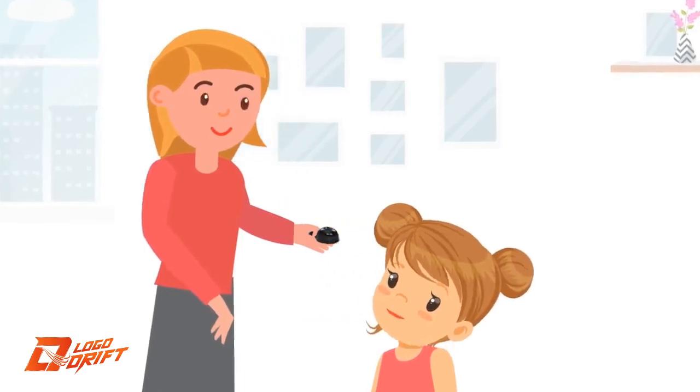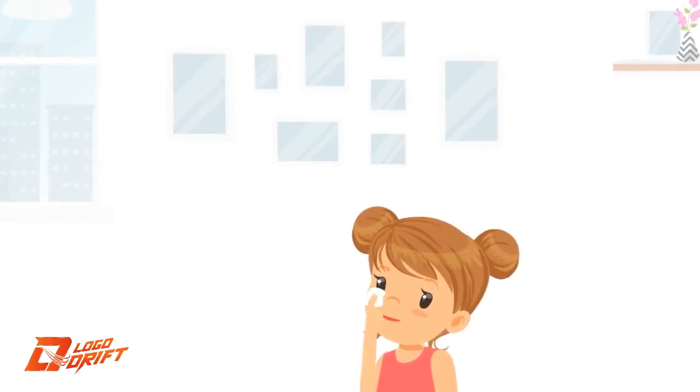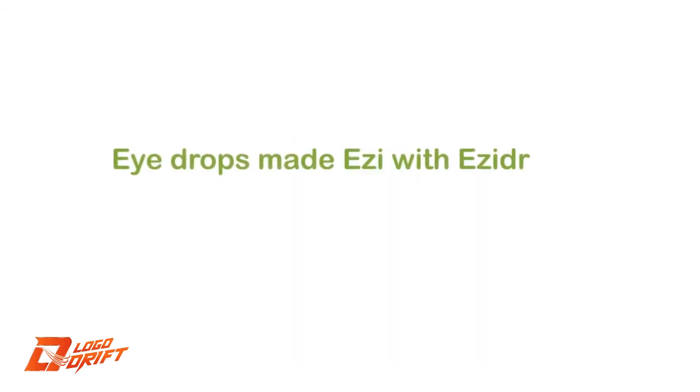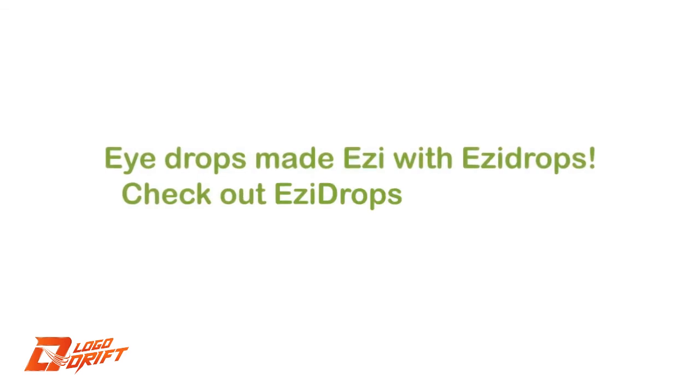Gently squeeze. At this point, many individuals will flinch the moment the drops hit the eye, prompting you to raise the Easy Drops applicator back. Ask the person to wipe off any excess liquid and you're done. Eye drops made easy with Easy Drops — check out easydropss.com today.